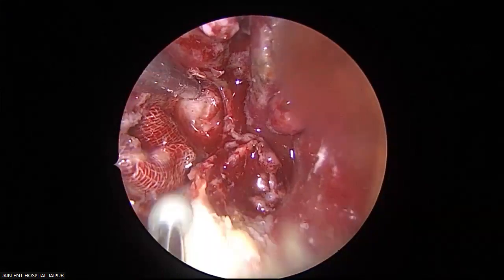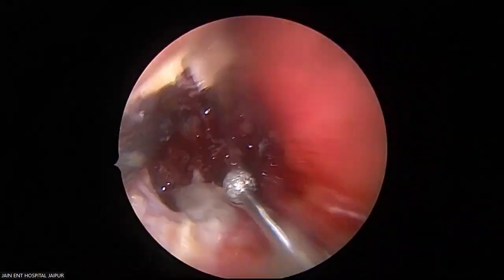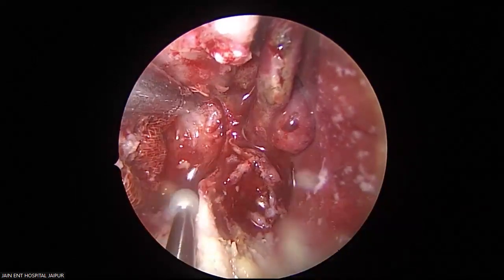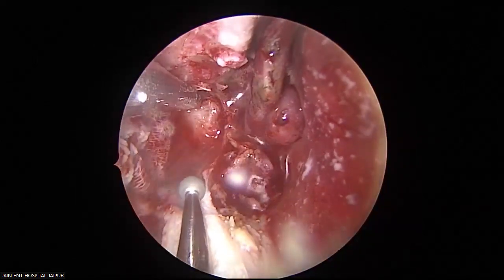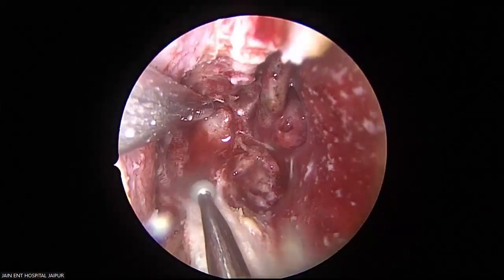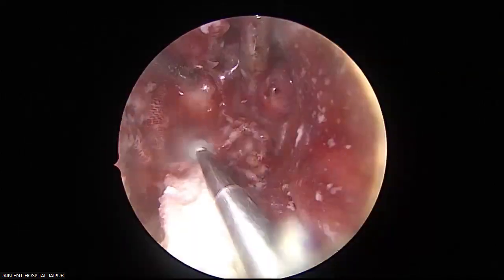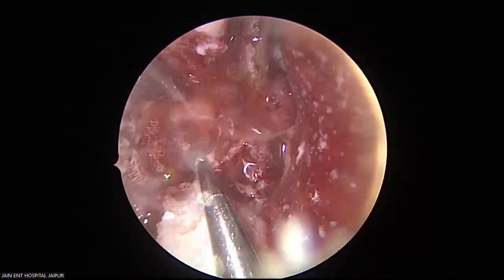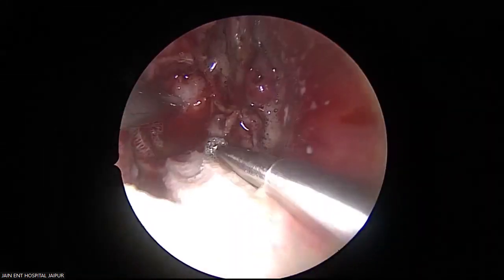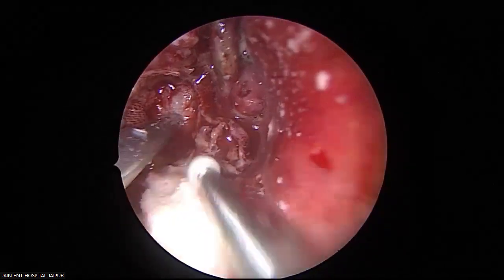So everything is being done for exposure. Now we have a good anterior exposure and anterolateral exposure as well. See, our instrument should go inside uninterrupted. This is how the space is being created for that. See this medial wall being flushed with the floor. You can see with the floor here.